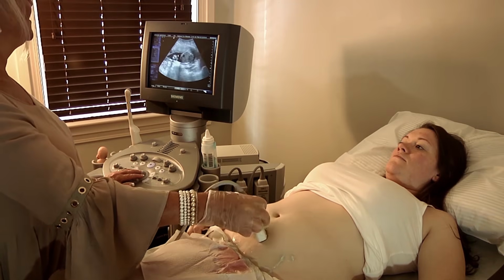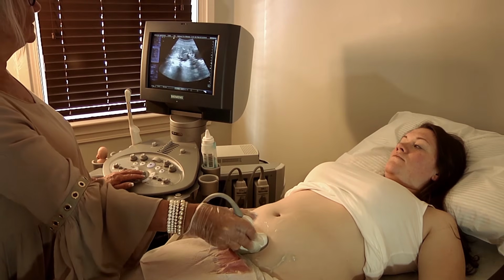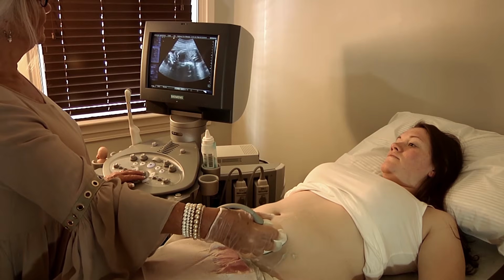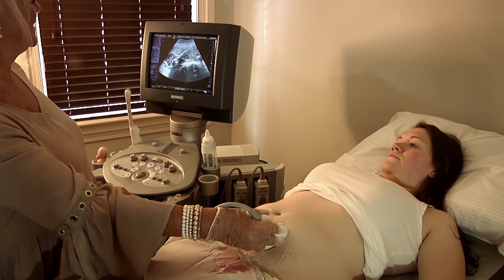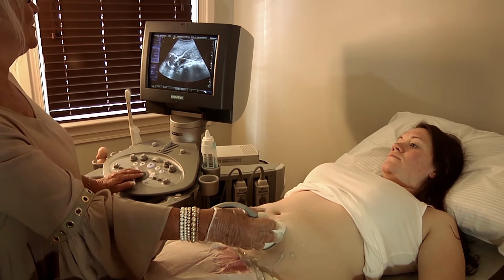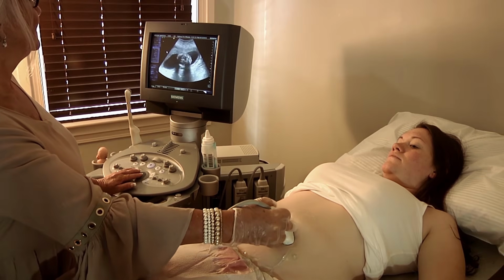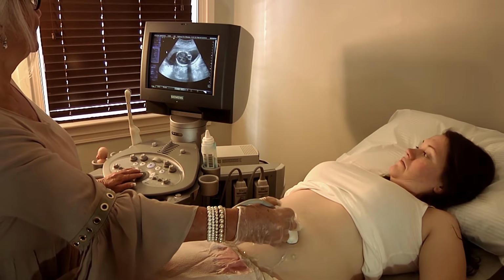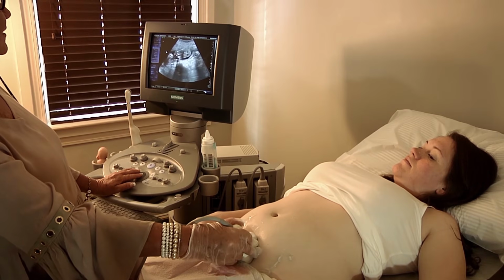And then what we want to do is turn on the baby, find the baby's lie, and that's the baby's lie right here, okay? And he's looking spine down, so he wasn't in good BPD. Went 90 degrees. Here's our head, and our heart, and our femur.